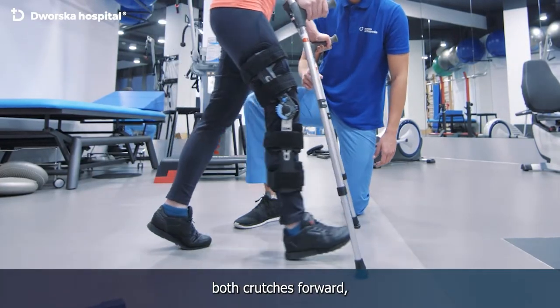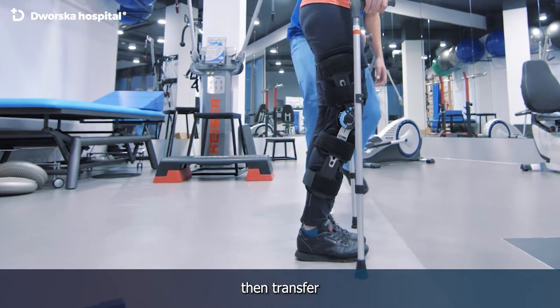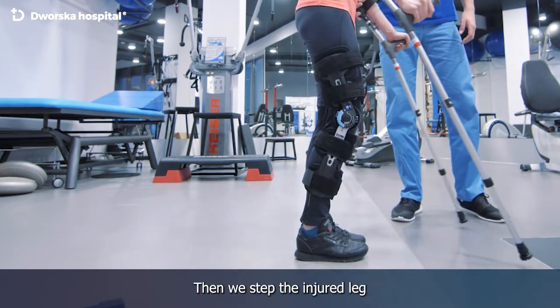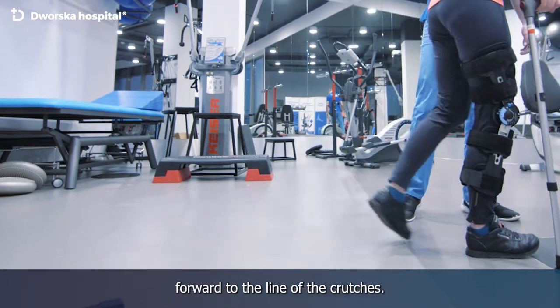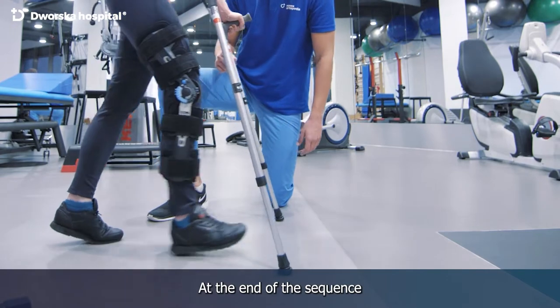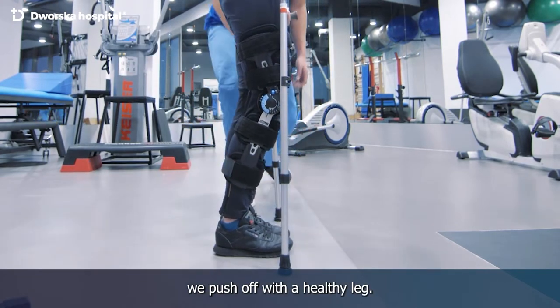We start by putting both crutches forward, then transfer the weight of the body on the crutches and the healthy leg. Then we step the injured leg forward to the line of the crutches. At the end of the sequence we push off with the healthy leg.